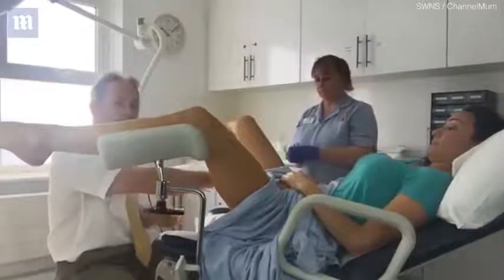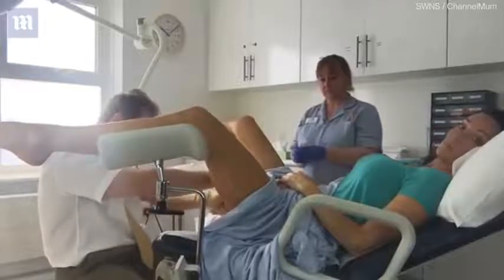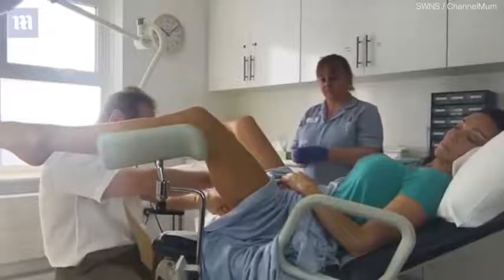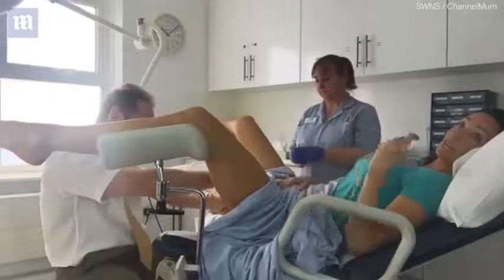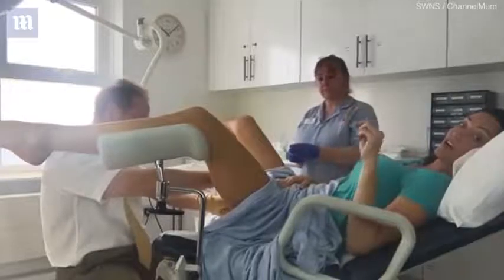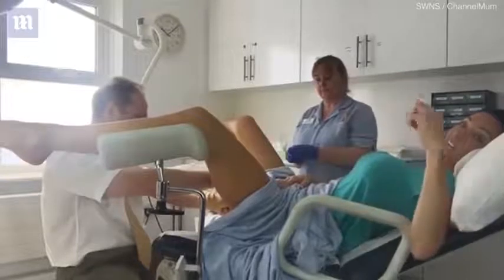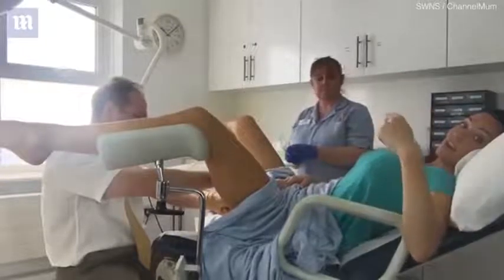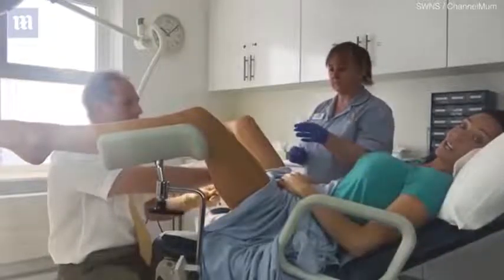Okay, so I'm now looking at Anna's cervix, and I have my little brush, and we basically pop that onto the cervix, and we literally just rotate it round several times. Again, I can feel that. It's not desperately comfortable, but it's certainly not hurting me at all. It just feels like a tiny kind of brushing inside, but it's really not hurting me at all.